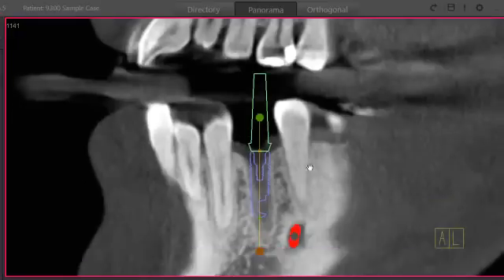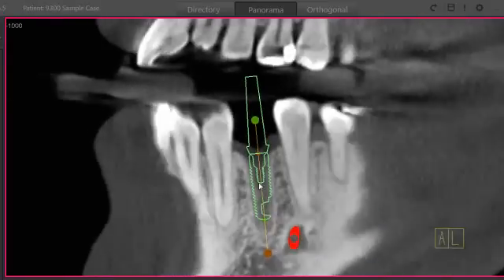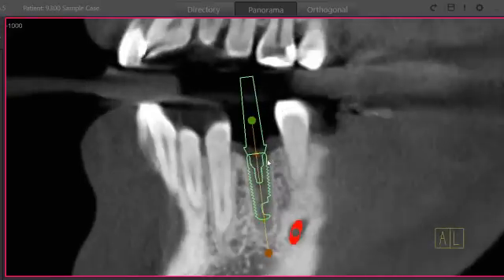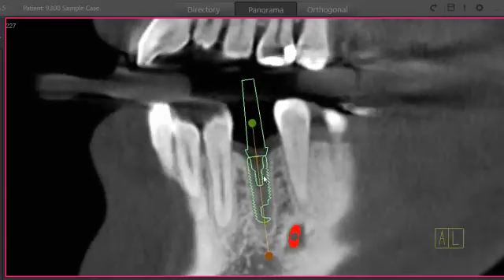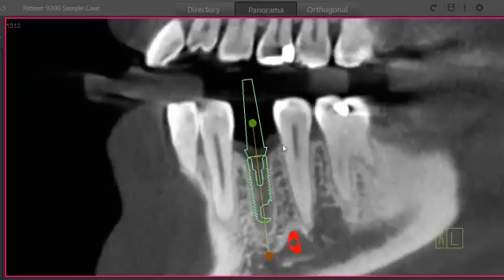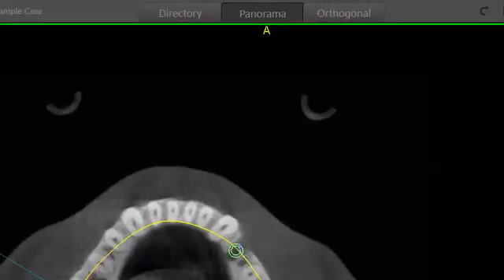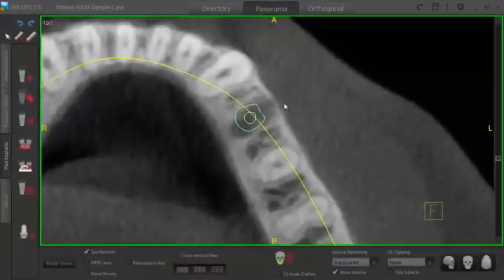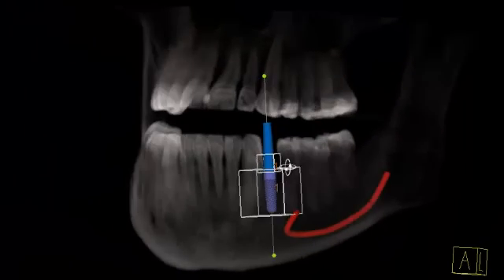Once finished there, we'll move over to the transaxial view, which allows us to roll around the implant as opposed to through it the way the cross section does — so we can really get our angle dialed in and check our mesiodistal spacing. Now we can go up to the top right to our axial view, get right over the center of the implant, and roll through our slices.